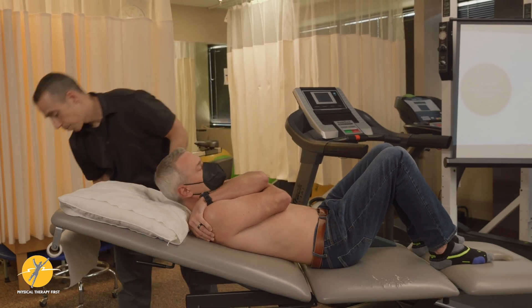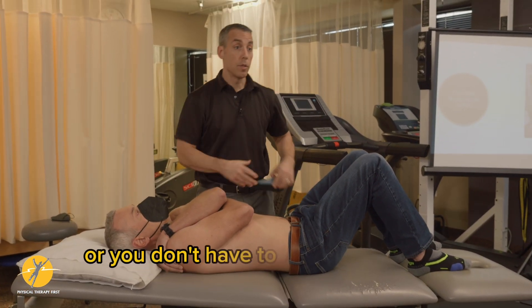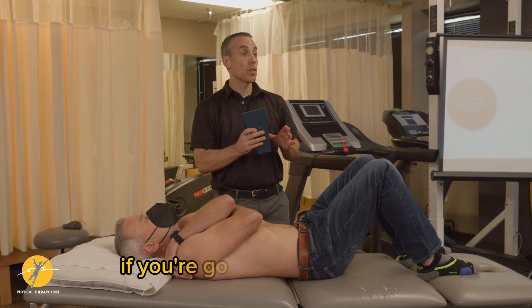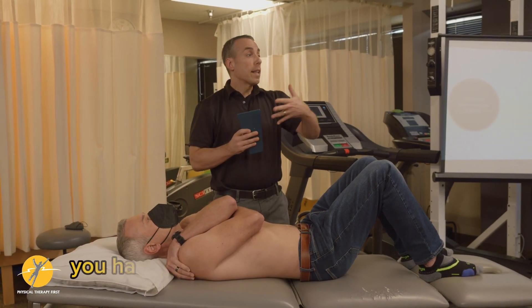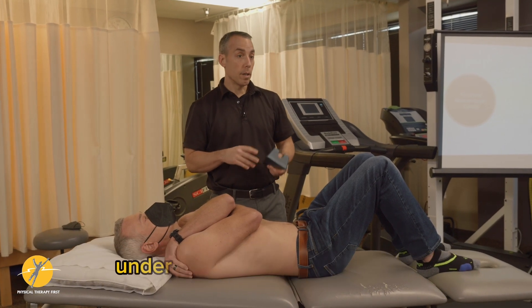Another way — and you can have this inclined a little bit or you don't have to — is you can use a wedge. Now, if you're going to use the wedge, you have less feedback under your hand and you don't want the patient to feel like they have a brick under them.